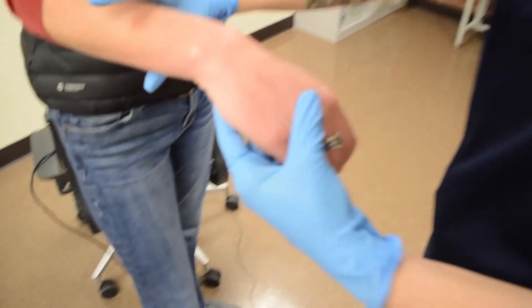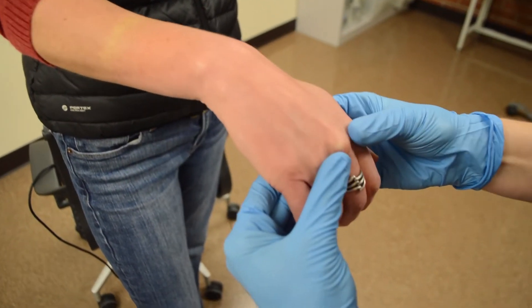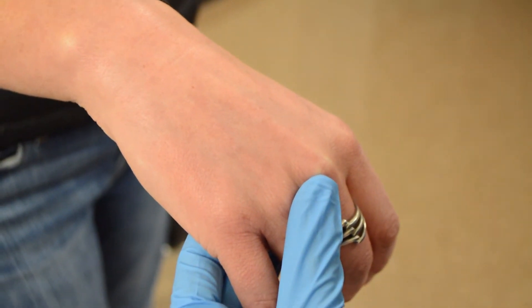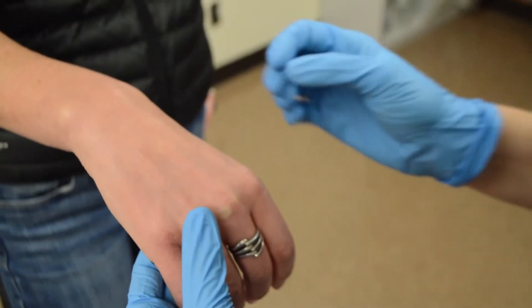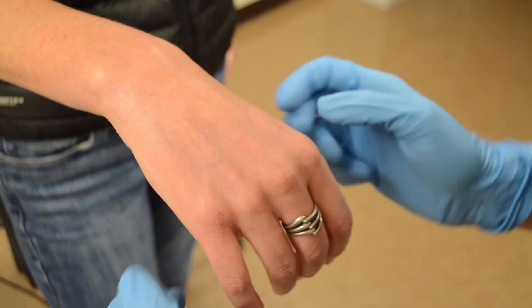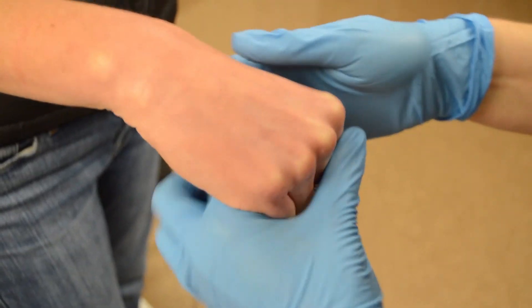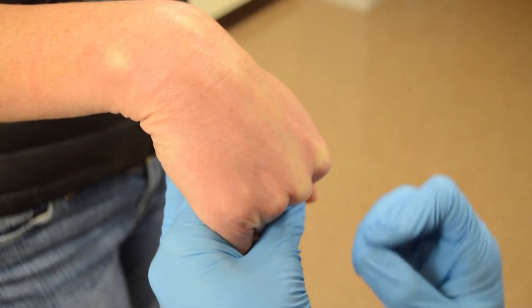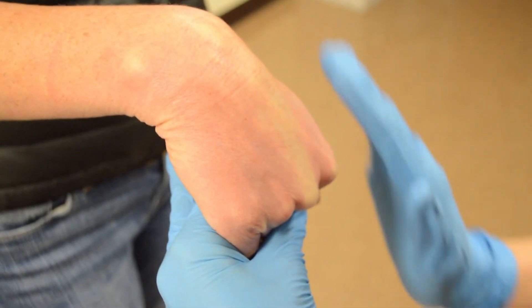When you have a hand, you want to start your tourniquet down here — not too close, just a little bit further away. Hand veins are very surface, so you don't need to go at a very steep angle to find your vein. They're also bony and have a lot of nerve endings, so it's more painful for the patient. There are a few ways to hold the hand — you can either have the patient hold your hand or you can curl the hand under. It's always a good idea to angle down so you can come up at the vein at a more straight approach, on the same plane as the hand itself.